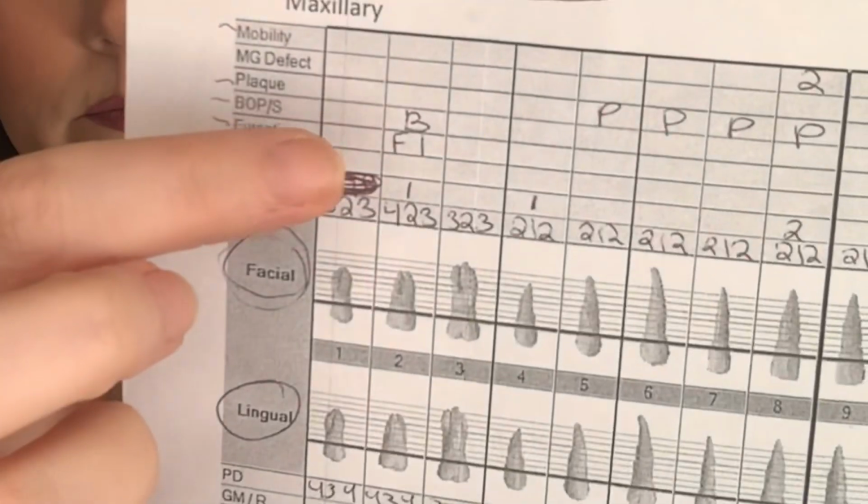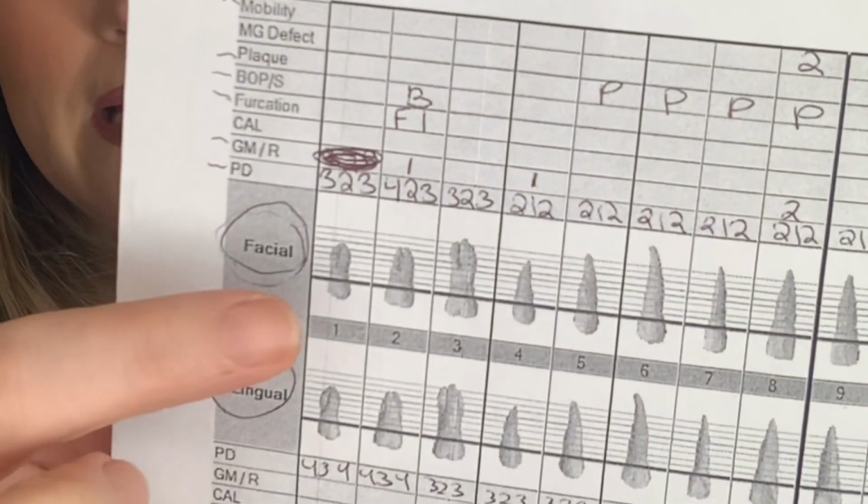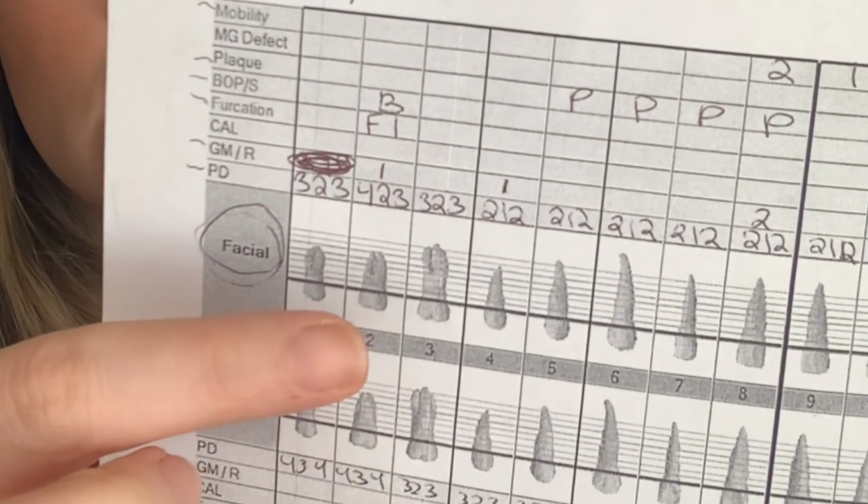But bleeding is when they're taking these measurements, if there's any bleeding of the gums that is occurring. So they'll tell you where that is. It might be like 4 mesial on the facial or 5 distal on the lingual. And basically you just put a B there if there is bleeding. See the little B there. So this bleeding happened on 2 facial.